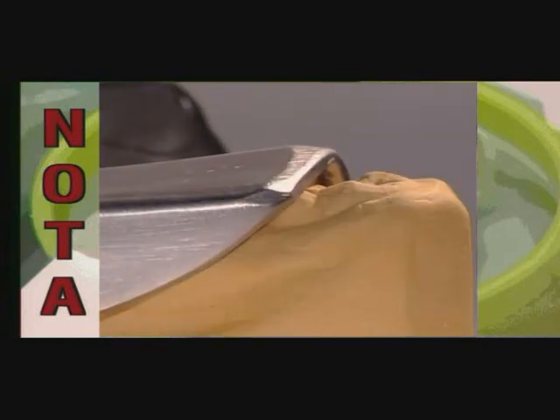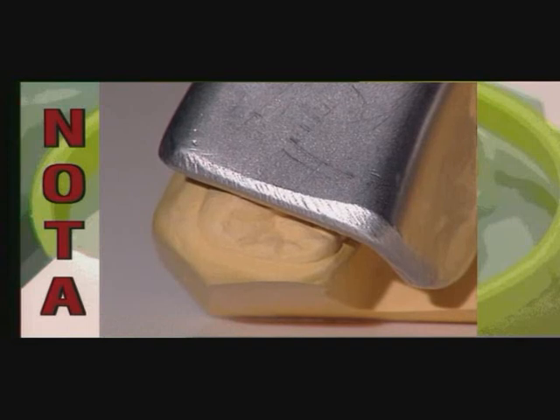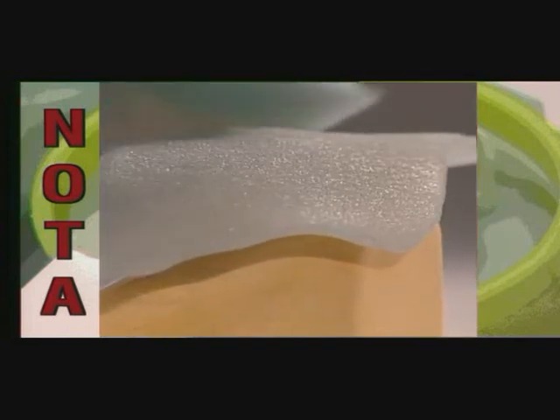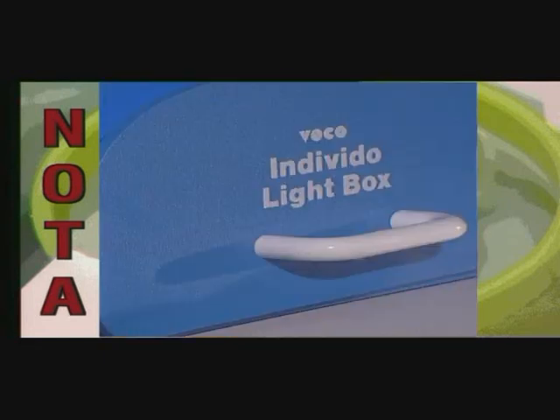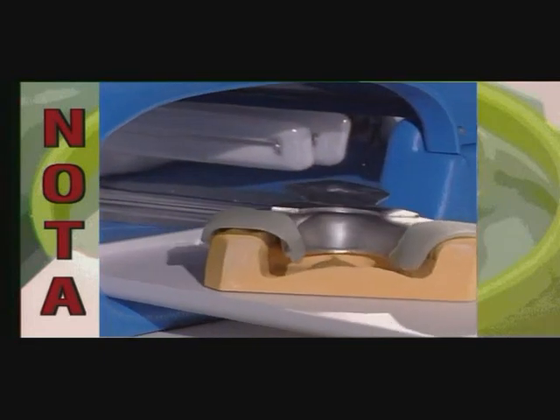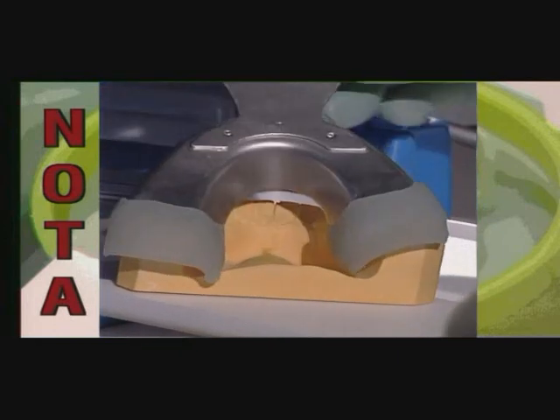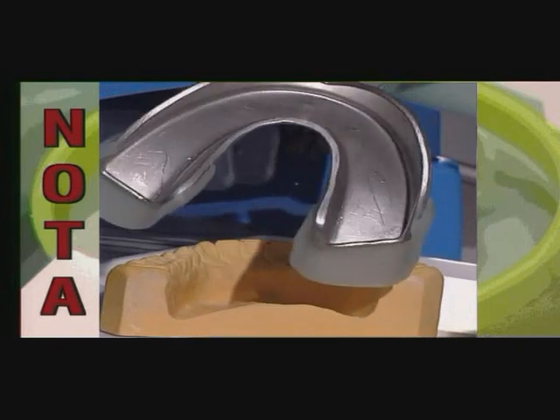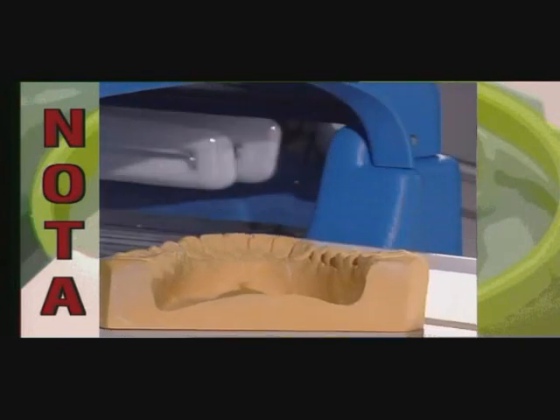With the furthest distal teeth, the alginate is mostly not supported by the tray. Often, therefore, only an inadequate impression is taken of them, or they're left out completely. In these cases, an individual tray can be made by extending the tray with light hardening plastic from a stock tray. After the try-in, the extension is cured in a halogen light device.